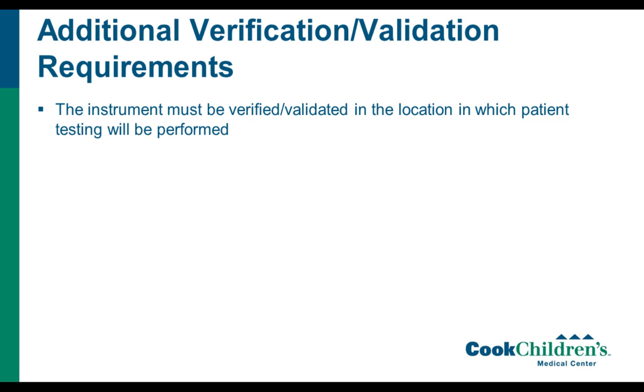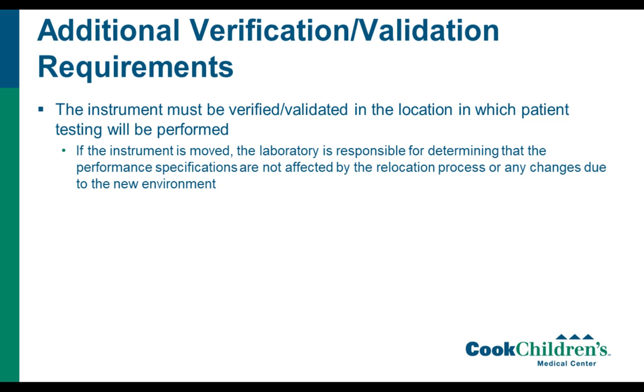In addition to those specific requirements, there are also a couple more requirements. So one is that the instrument must be verified or validated in the location in which patient testing will be performed. So if you validate it in one place and move it somewhere else, you have to determine if that will affect the performance of the assay.